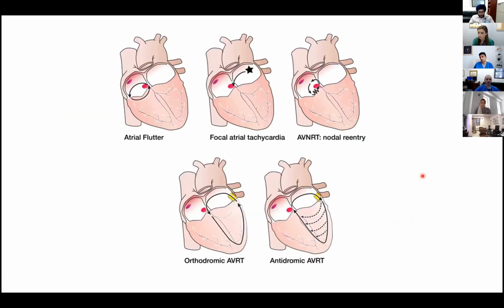So now what you need to understand: we went through all these lists, and probably some of you who are more interested in cardiology maybe know all these arrhythmias. Some of you who are not interested in cardiology maybe do not know. So I think we should go over how, mechanistically and anatomically, these arrhythmias look. And this photo is really essential for you to understand later how the genesis of the actual EKG works, why the EKG appears the way it appears.